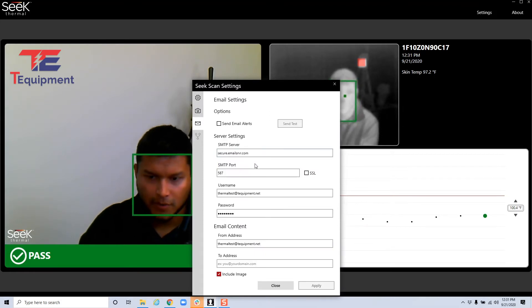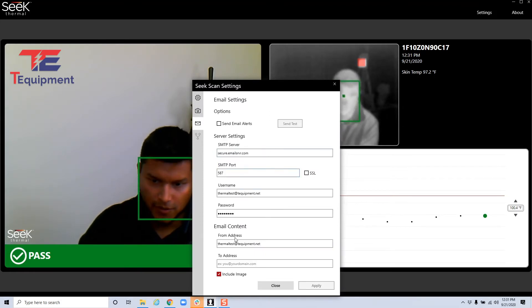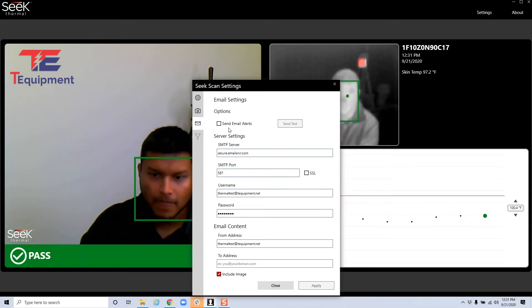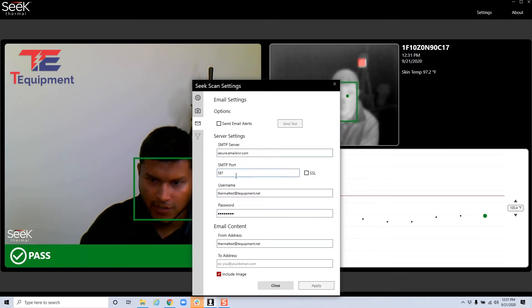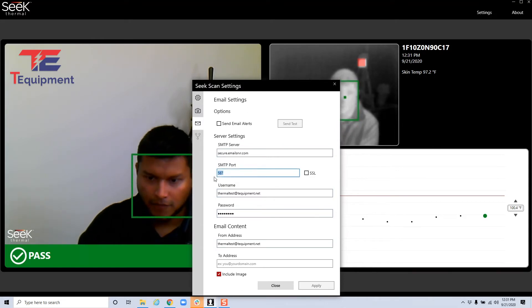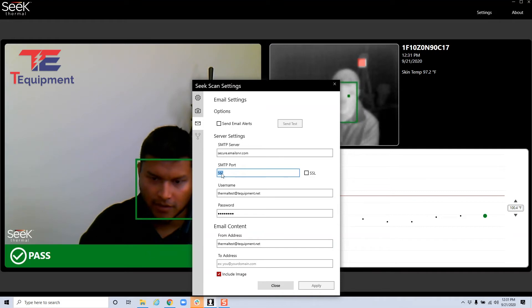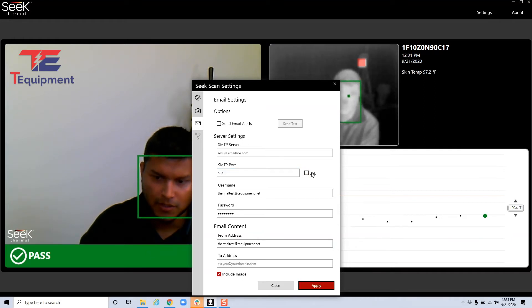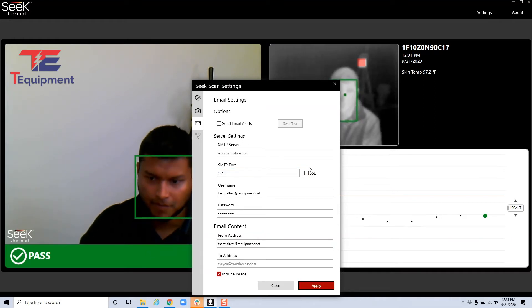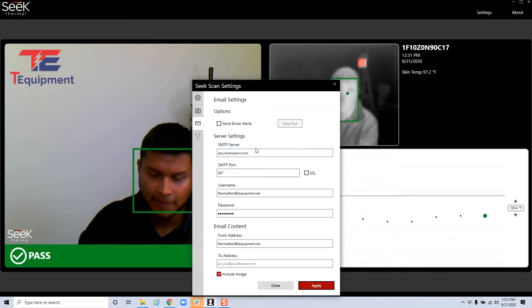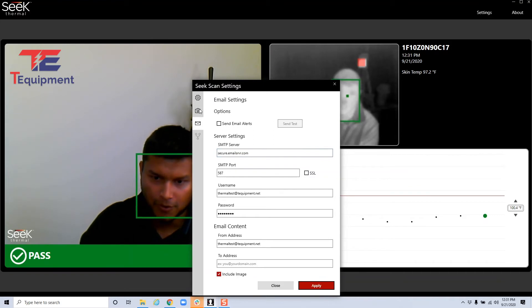You also have the email alert option so you can configure this with your own server and be able to send email alerts. If you are using port 465, 587, make sure you enable or disable SSL as needed, depending on your configuration.